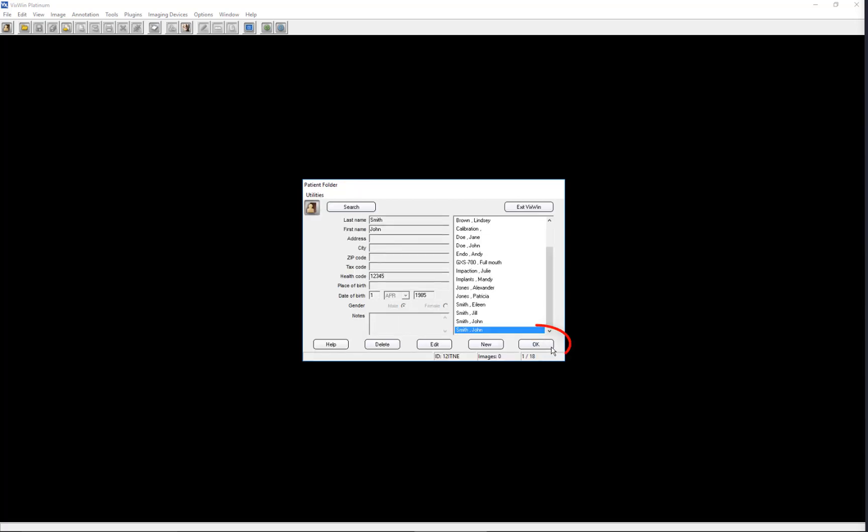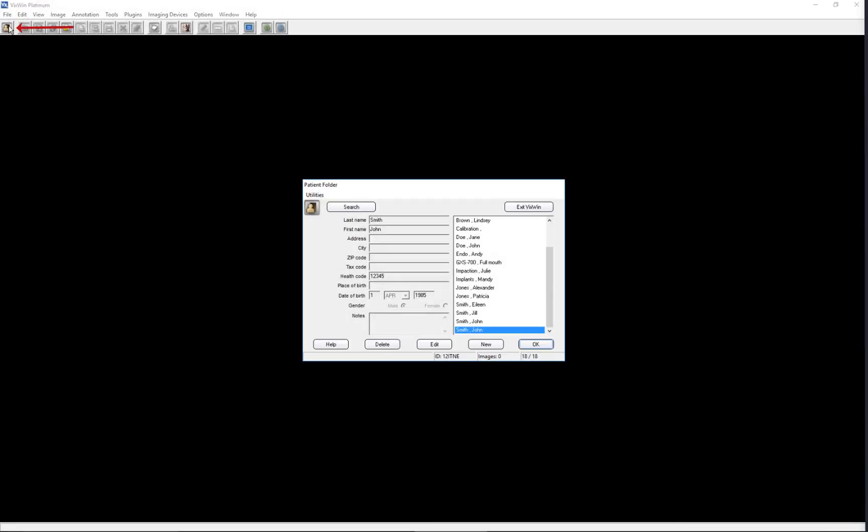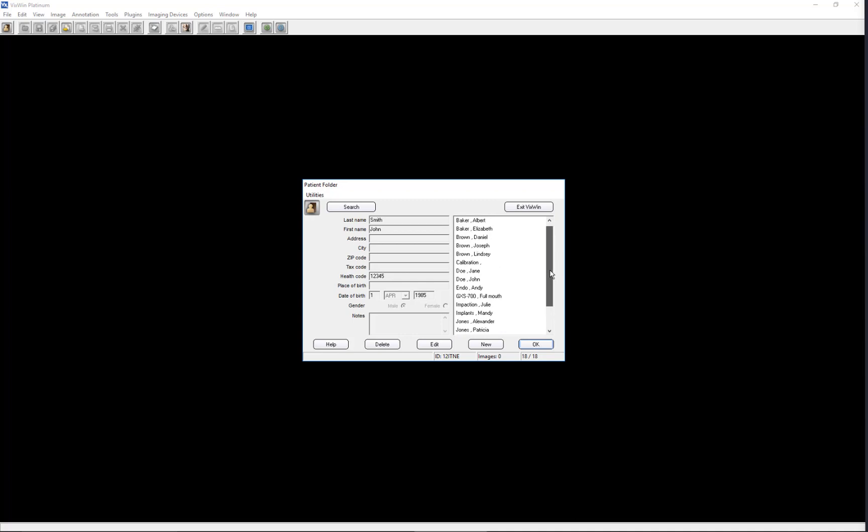Click OK to enter the name in the patient list. Click OK to open the folder for the selected patient. On the menu bar, let's click the patient folder button to return to the patient database. As the database grows, you can use the patient list scroll to locate a patient. However, you might find it more efficient to use the search feature.